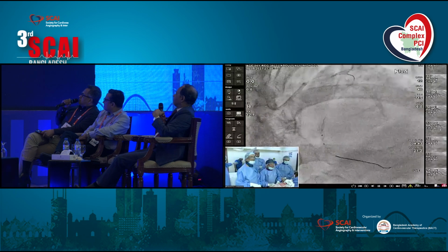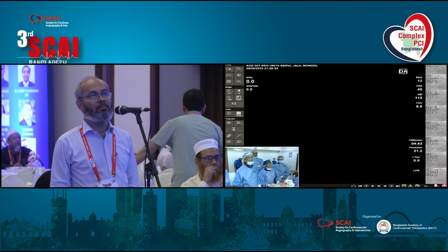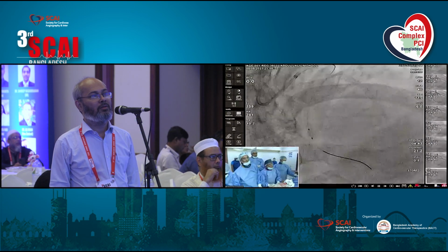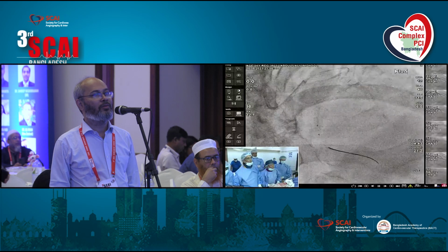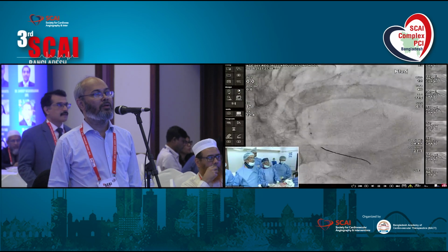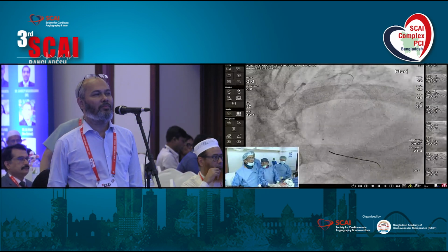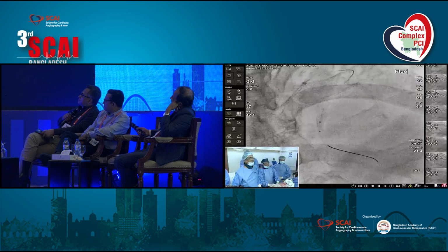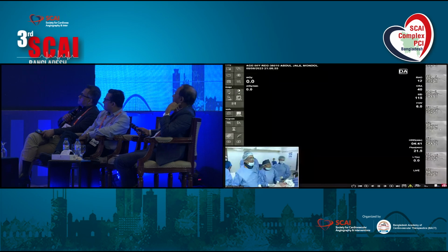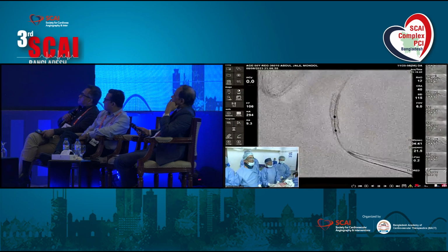So we should wrap up within 30 seconds. Do you have any last comment or question regarding the recommendation on antiplatelet therapy, particularly for these patients? Diffuse disease, long segment, long stent, with stent enhancement: DAPT for 1 year minimum is what is recommended, unless the patient has high bleeding risk. Whether ticagrelor plus aspirin 81 or 75 here, we'll continue for as long as we can. Okay, so this is a stent boost.